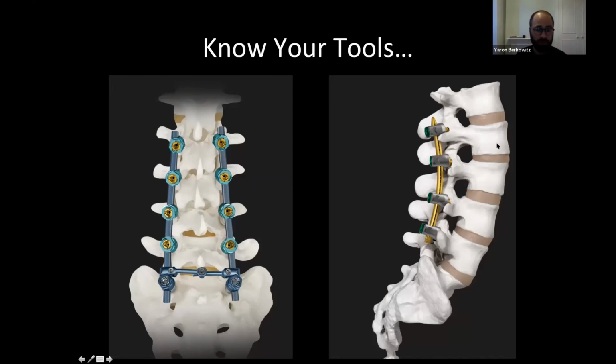Lateral, you're just not going to be in the vertebral body and may hit a vessel. Medial, you may hit the subarticular recess or lateral recess. So sometimes I say subarticular recess instead of lateral recess. It's just because neurosurgeons and some surgeons differ in their terminology, but it's the same thing.